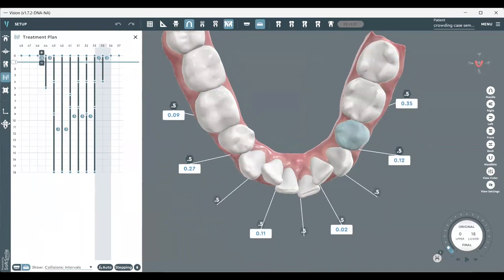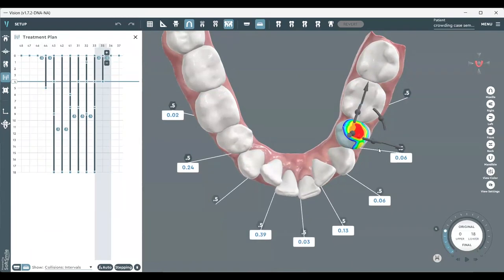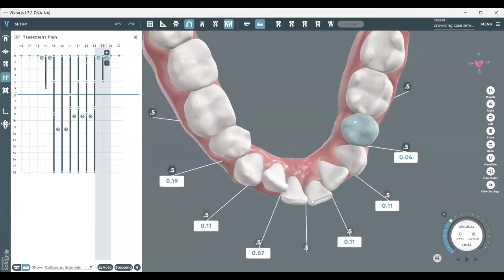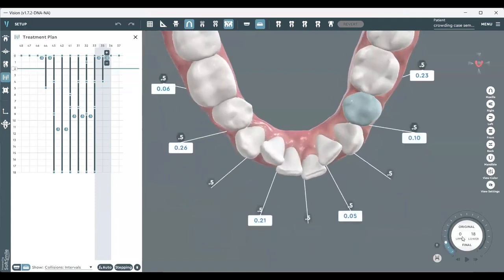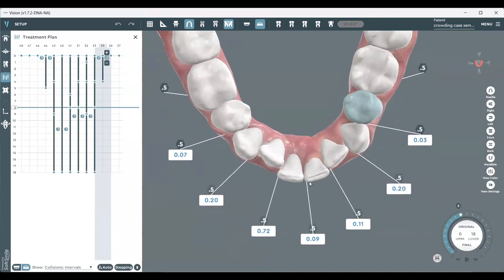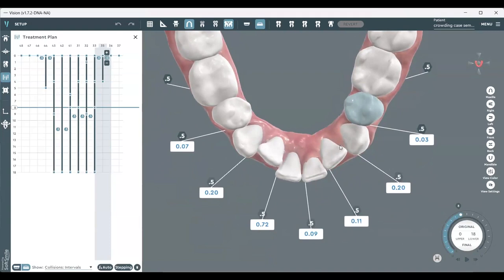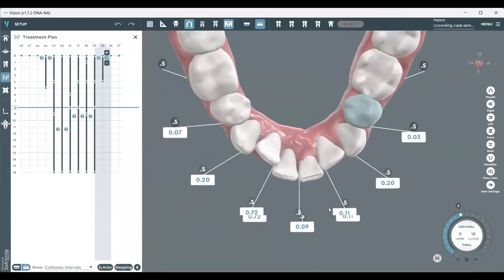Here you can see it is starting there. And to do expansion, we move distally these ones to make expansion. This is a protocol that we saw in the last treatment, that is a zero tolerance protocol. So we open the spaces around the teeth with expansion. And when we have a better alignment, like this in here between centrals, canine and laterals, it's better aligned, we open the spaces to make the IPR.